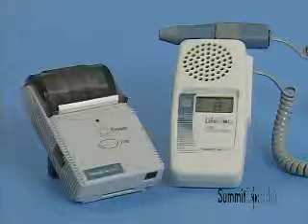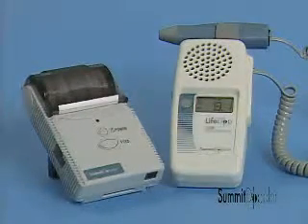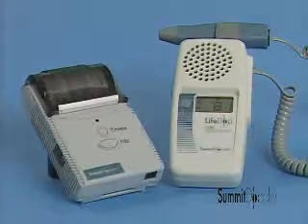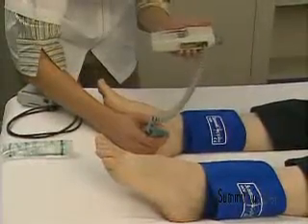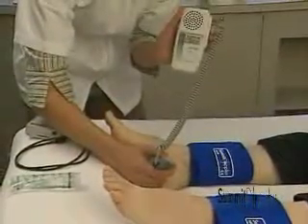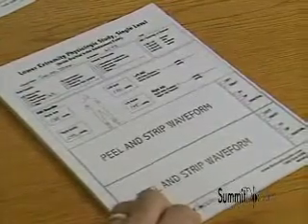The LifeDop 250 ABI is the premier handheld Doppler for performing the ankle brachial index, or ABI, exam for the diagnosis of peripheral arterial disease, or PAD. The system includes a bidirectional handheld Doppler and portable high-speed printer. In this section, we'll show how to set up the system and perform the ABI examination, including Doppler waveform acquisition and documentation that is required for reimbursement under CPT 93922, the exam code for the single-level bilateral lower extremity physiologic study.